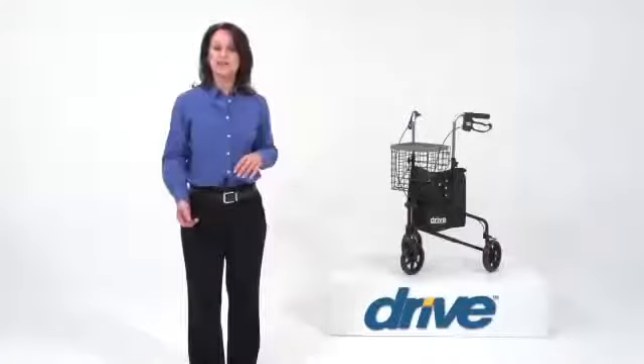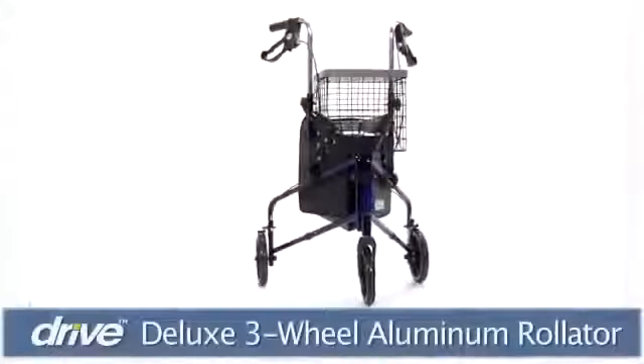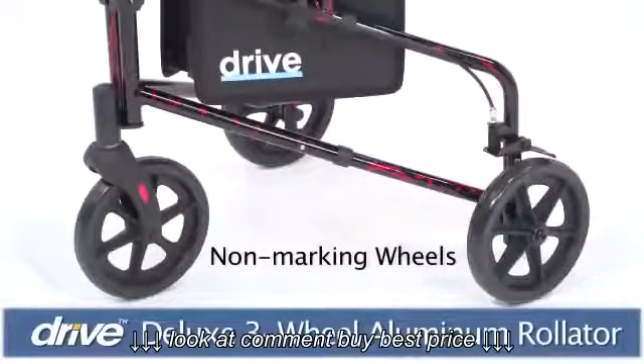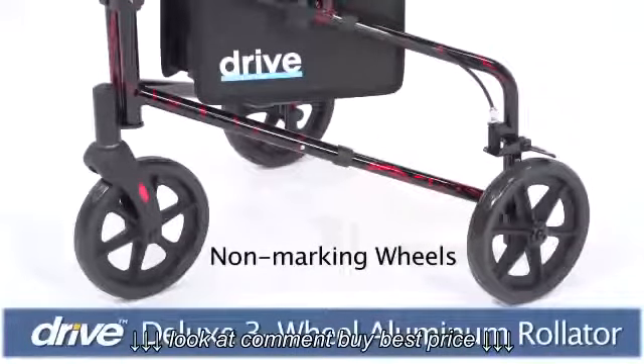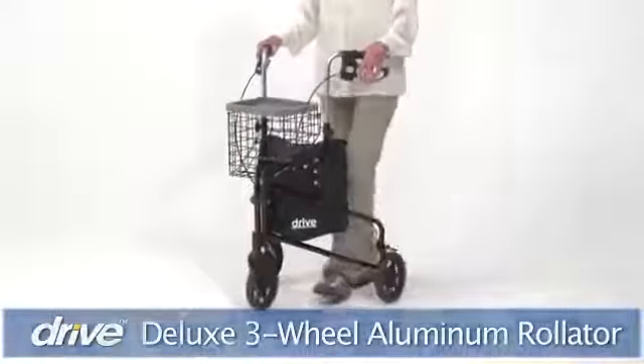For active individuals wanting support and a convenient way to carry items when mobile, Drive Medical's three-wheel rollator is the answer. These solid 8-inch wheels keep users up to 300 pounds stable, which is especially helpful when navigating uneven surfaces. And the front wheel swivels, making it easy to turn or change direction.